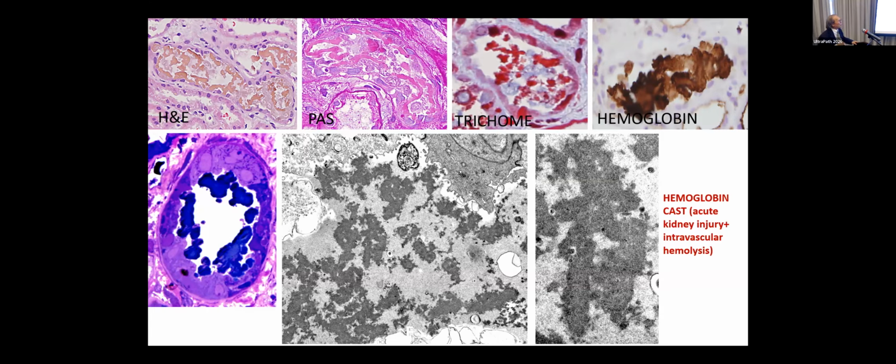When you do immunohistochemistry for hemoglobin, they're strongly positive like that, and we could catch in the thick sections a hemoglobin cast, and structurally it looked like that. You can see an irregular geographic structure composed of very, very dark granules and fibrillary material, and that's a higher magnification of that, reflecting what we see in the light microscopy. Again, interestingly, the background of this is the uromodulin material.